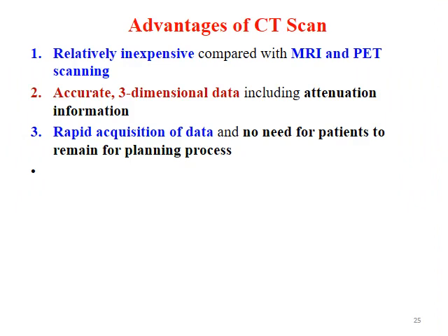Advantages of CT scanning are that it is relatively inexpensive compared with MRI scanning, it gives accurate three-dimensional data including attenuation information, it allows rapid acquisition of data, and there is no need for patients to remain for the planning process.